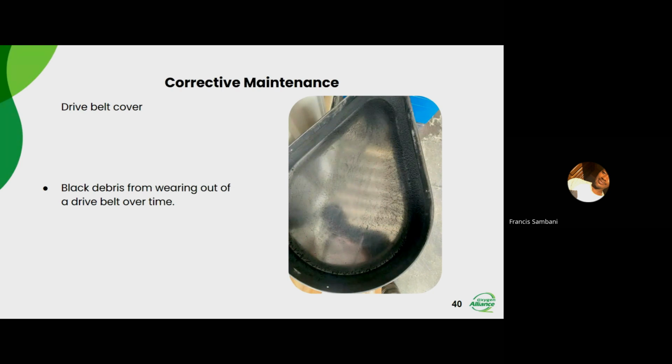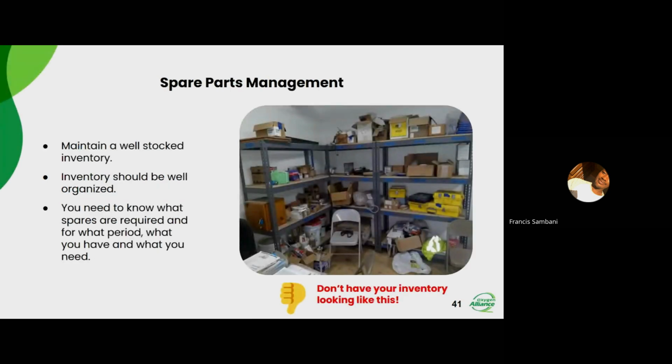Next up. So in terms of how you can take good care of your spare parts, having spare parts on site is very crucial, because if you have spare parts on site, in case you have a breakdown, that would reduce the time for you to have your plant back to service. And also, you should make sure that you restock your spares as soon as they're running out.